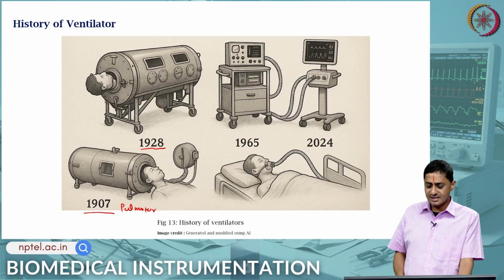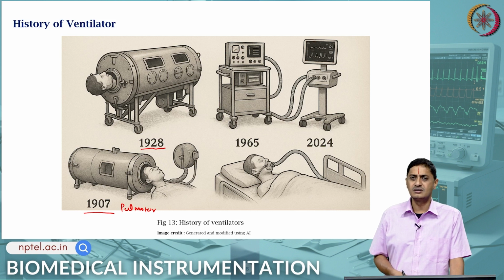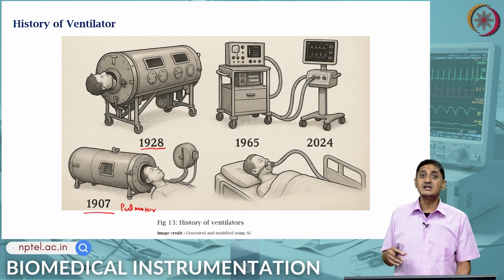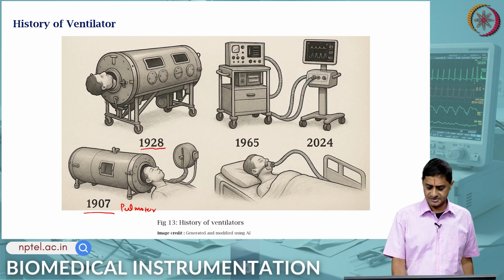Right. Then from 1965 onwards, you have the modern feedback control based systems, and in 2024 you have this feedback control that may probably be beginning to assist using machine learning and AI, maybe providing tailored feedback, tailored input, etc.